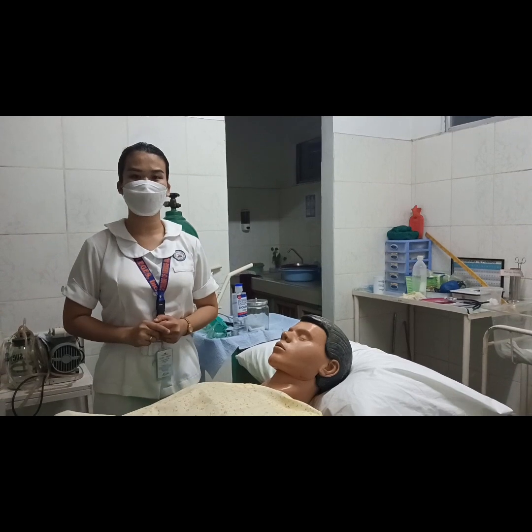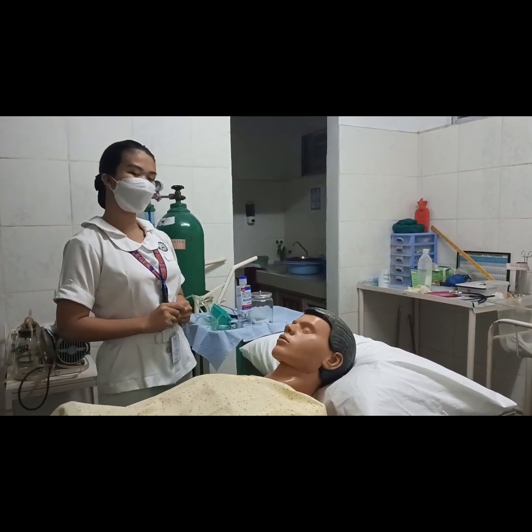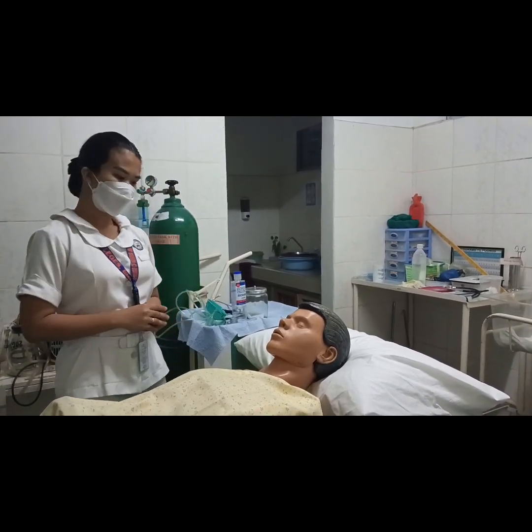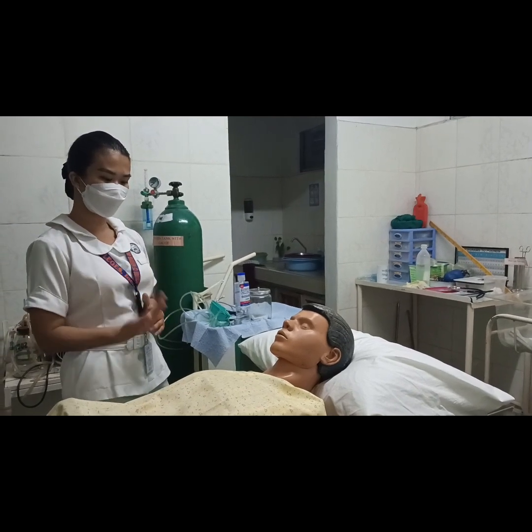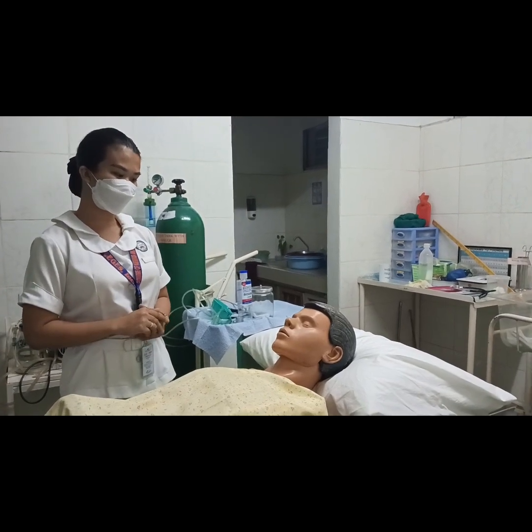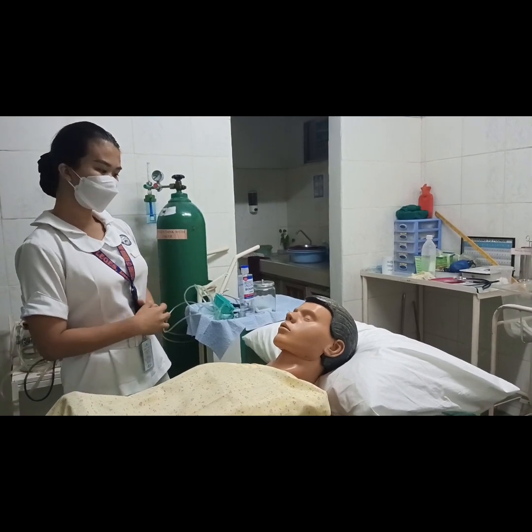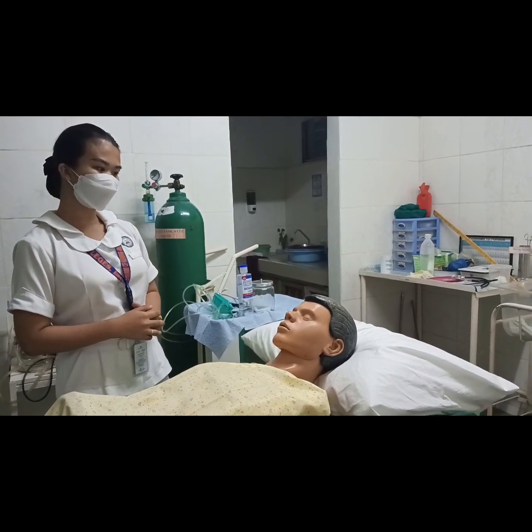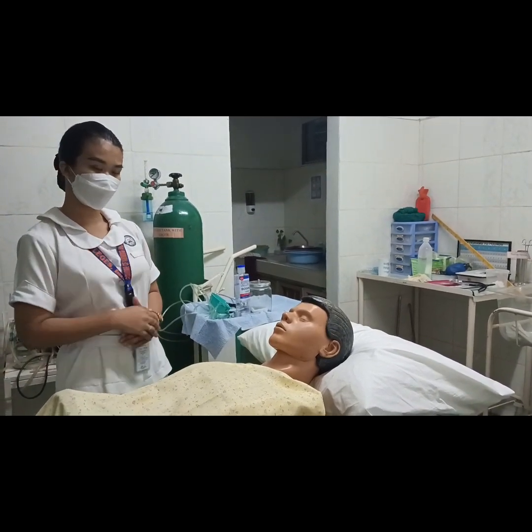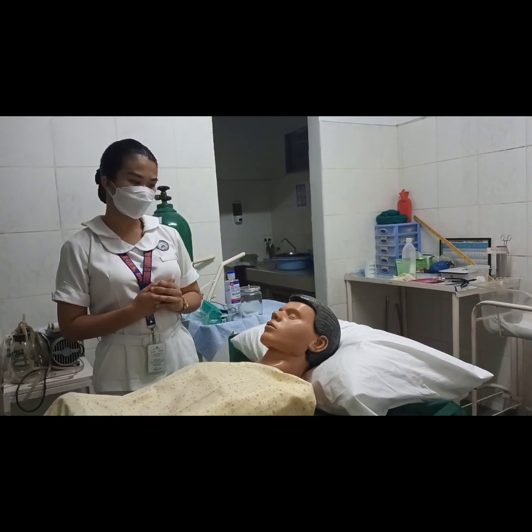Good day. Today I'm going to demonstrate how to administer oxygen therapy. First, for the assessment, I'm going to check the vital signs of the client — his respiration rate, pulse rate, blood pressure, and body temperature. I will also determine the level of consciousness of the patient, if he can respond to me, and I will assess the breath sounds of the patient.